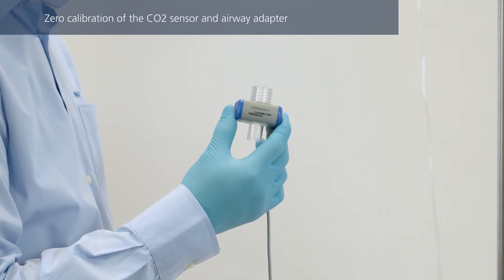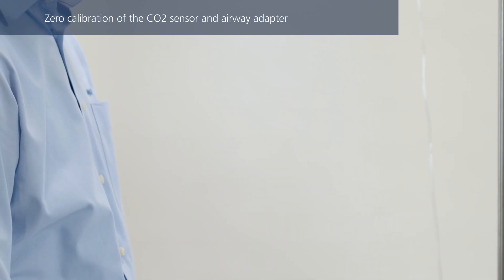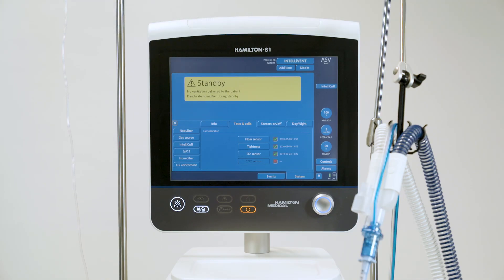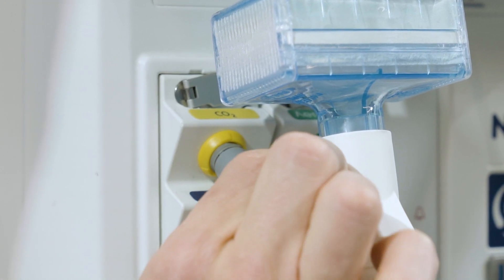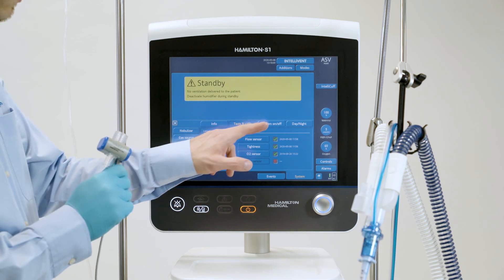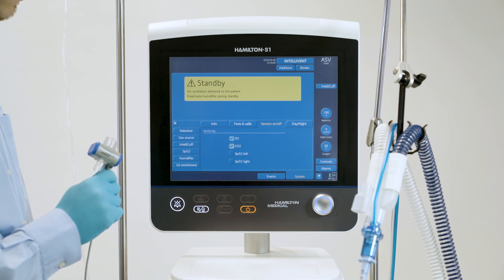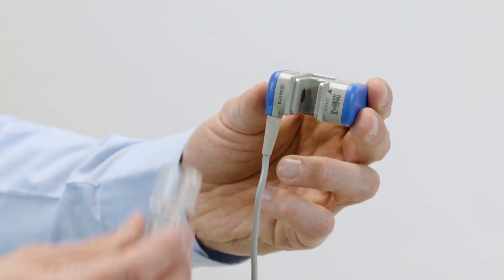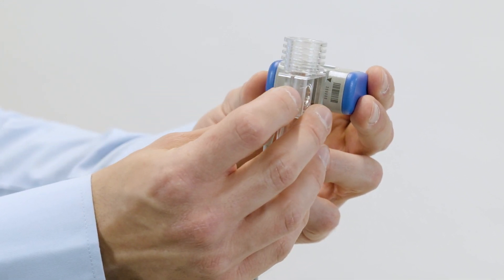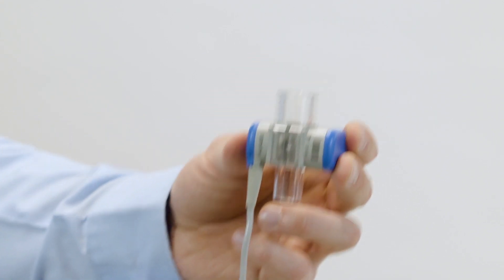As CO2 sensors are already calibrated at the factory, you only need a zero calibration with the first use of the sensor, when changing between airway adapter types from single use to reusable, or when the alarm 'CO2 calibration needed' is generated. Connect the sensor to the ventilator and check if CO2 monitoring is enabled. Wait approximately 90 seconds for the device to warm up. Connect the airway adapter to the CO2 sensor and keep these components away from all sources of CO2 and the exhaust port of the expiratory valve.